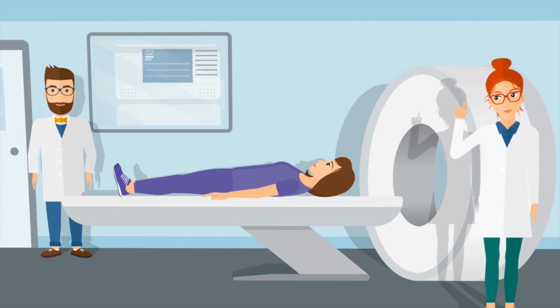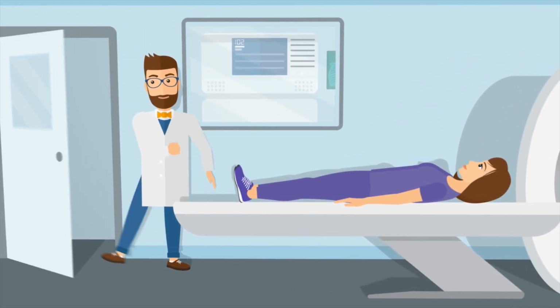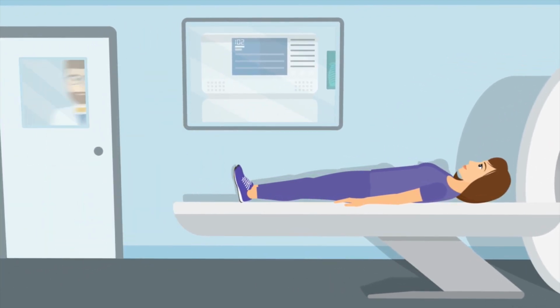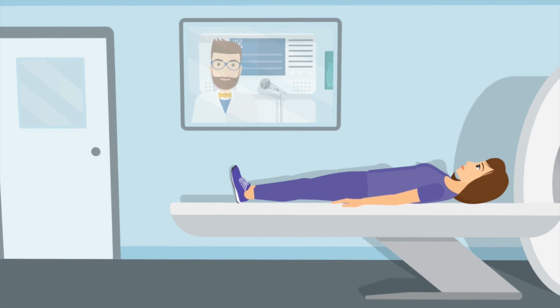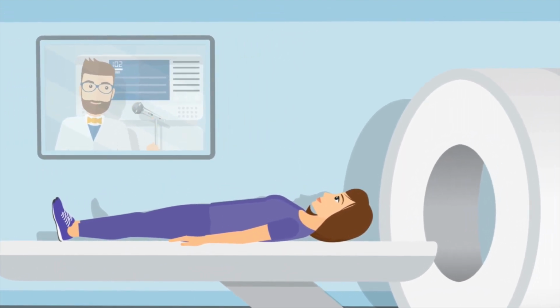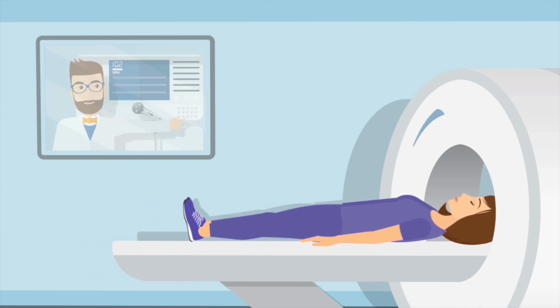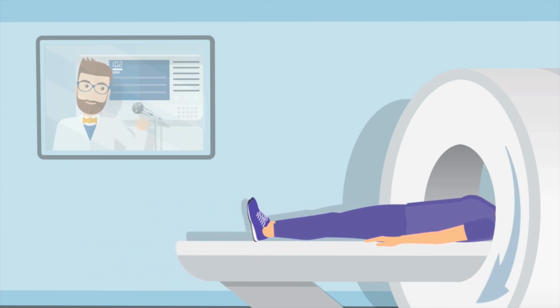Once you're comfortable, the technologist leaves the scanning room to control the examination from a console next door. The technologist will be able to see, hear, and speak to you at all times by intercom and through the viewing window. You may be asked to hold your breath at certain moments, and the table will gently move you into the scanner, and its detectors rotate around you as it completes each separate view. You may hear buzzing, clicking, and whirring noises.